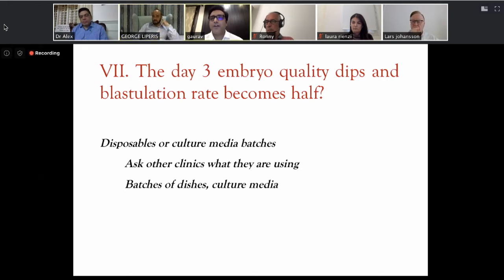I'll interrupt you, Laura. What is your opinion on light and exposure to light in the laboratory? Okay, there are different light sources. If it is sunlight, I completely agree. We have to avoid any windows and any direct sunlight, of course, because it brings UV and a lot of other potentially dangerous sources of contamination for the embryos.